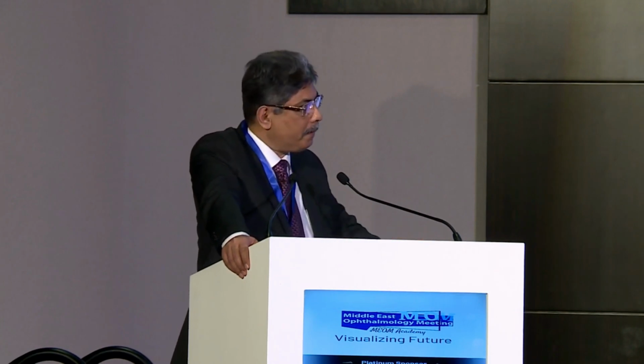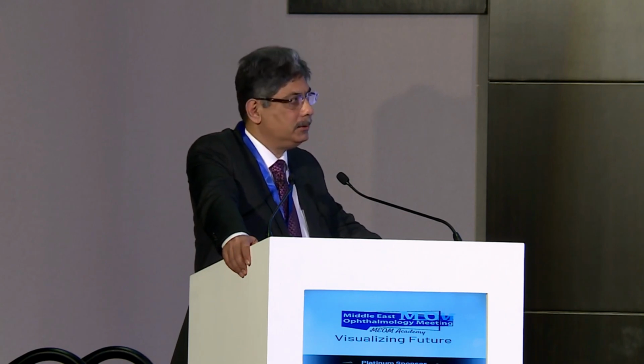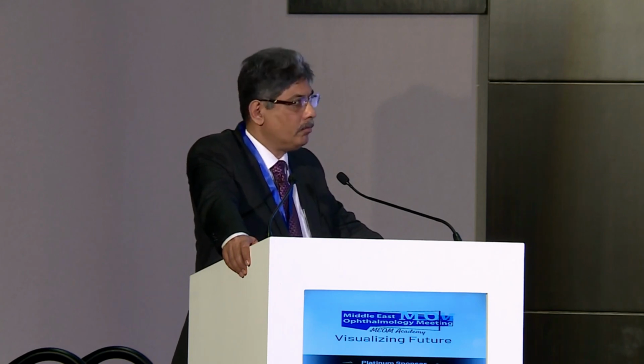This is just to avoid confusion, but otherwise it's very important. He clarified that the part is engaged already. Otherwise, you can induce vitreous loss or more vitreous loss. And this is the question you should ask yourself when you identify a posterior capsule rupture: is there vitreous or no vitreous, and you will manage accordingly.